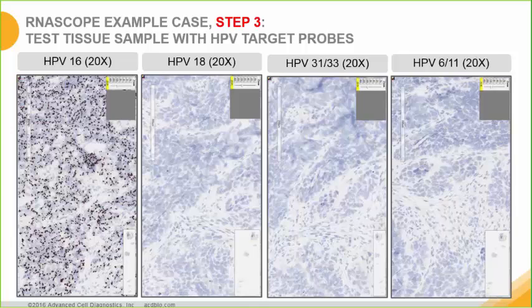Having confirmed that the RNA quality in this tissue sample is suitable for RNAscope, we can now test the tissue sample with the target probes. In this case, various HPV target probes. In these images, we are targeting several HPV subtypes, HPV 16, 18, and 31 to 33, which are high-risk HPV, and HPV 6 to 11, which are low-risk subtypes. As you can see, this tumor tissue is positive for HPV, seen with the brown dots, and negative for the other subtypes tested.